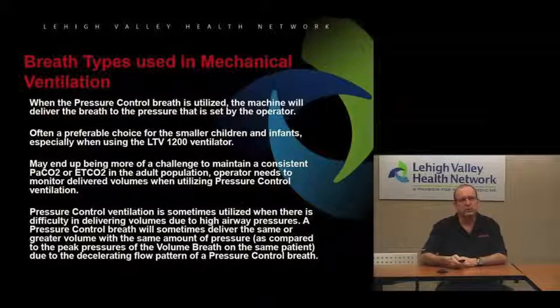Whenever you make a switch like that, though, you need to remember to keep an eye on your patient. Their saturations might change, their end tidal CO2 might change, their hemodynamics might even change. There might be a change in blood pressure one way or the other when you're switching the type of breaths you're delivering. Just something to keep in mind.